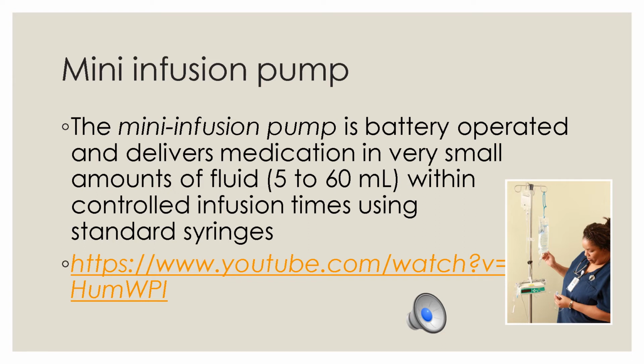Typically, these pumps give medications over 30 to 60 minutes at a time. So they might need an IV antibiotic, and it comes in syringe form because pharmacy makes it, and you can program the pump to run over 1 hour. But this is a good video, and you will have test questions on this. You won't have to demonstrate it though.